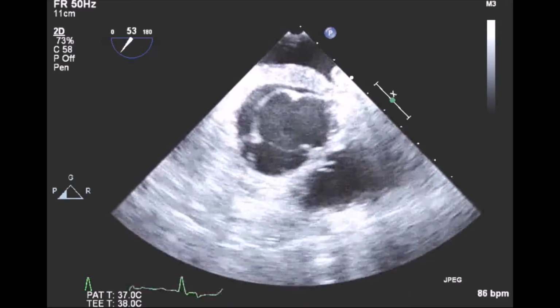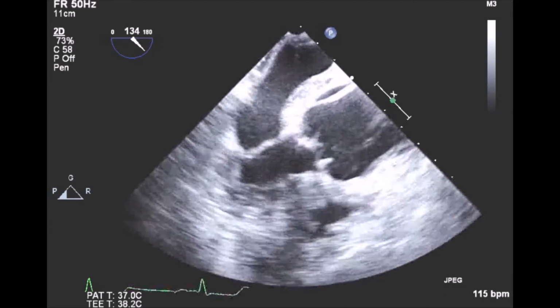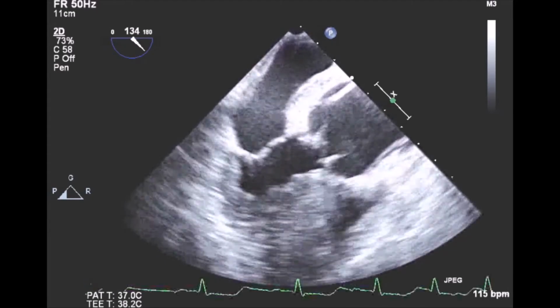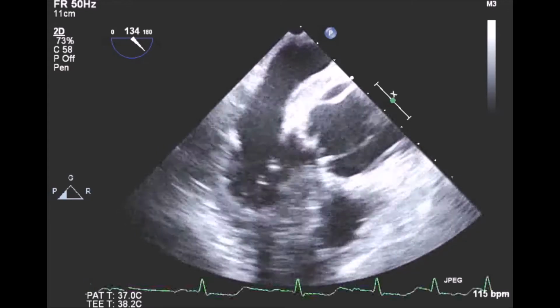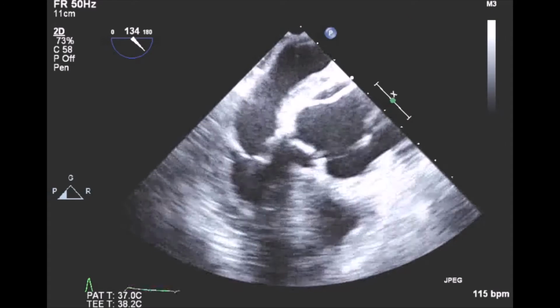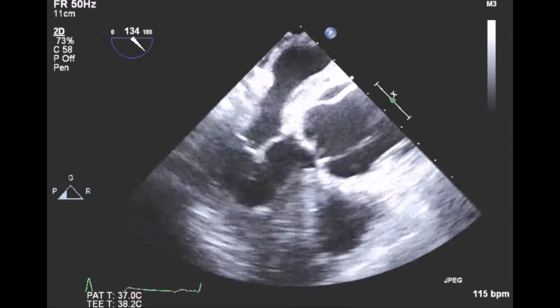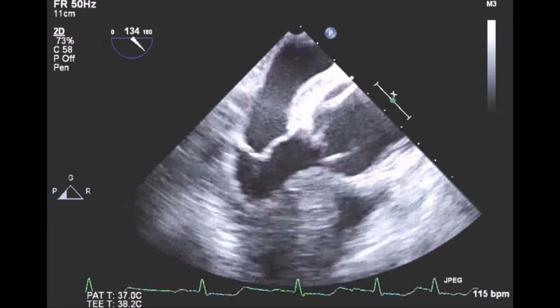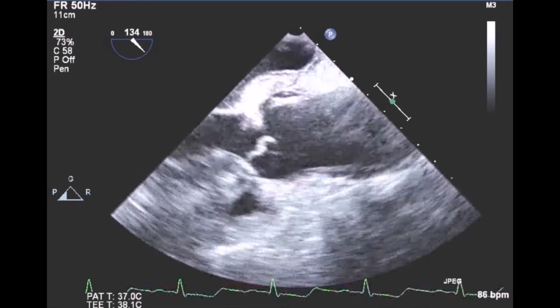This is a dissection flap that is noted. A short axis view of the aortic valve with the dissection flap going all the way down to the sinus of Valsalva. Again, the red arrows noting the dissection flaps. Also note in the middle of the image a flap moving in and out as a part of the flap tries to invaginate into the ascending aorta.